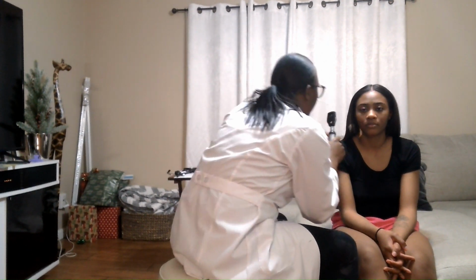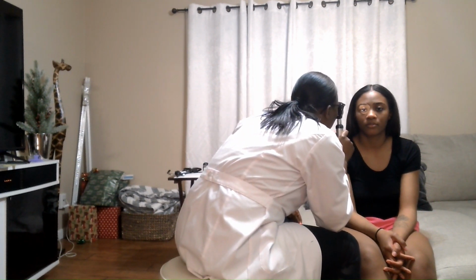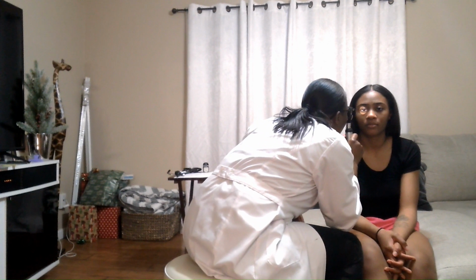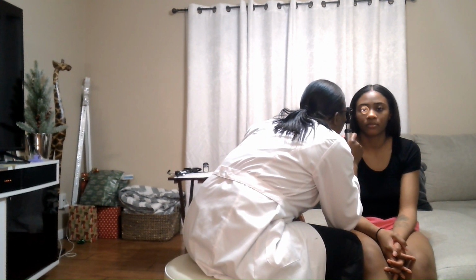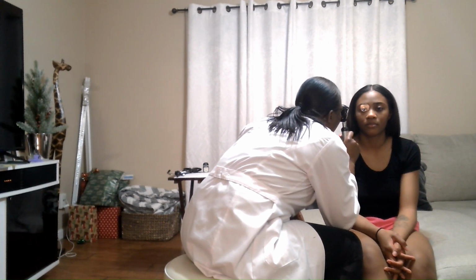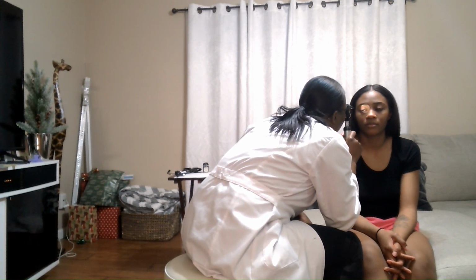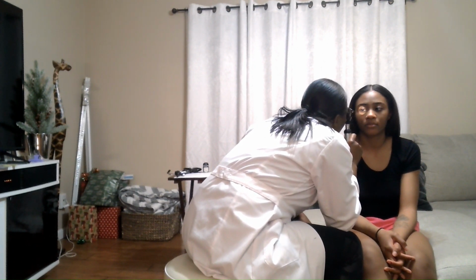And then I'm going to look in the back of your eye at your blood vessels. Okay, I see the optic disc. And I see the blood vessels and arteries. And I also see the macula. I'm going to have you look straight at me for the macula. Look straight into the light. Okay.